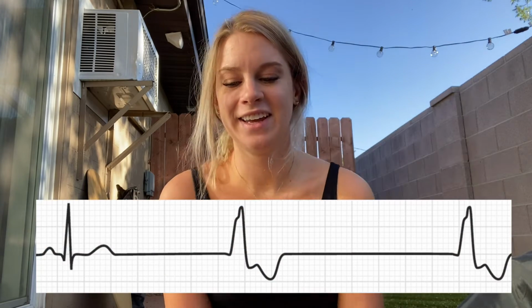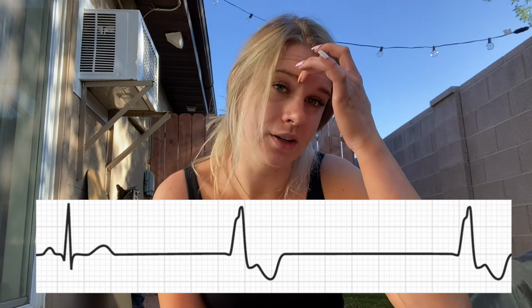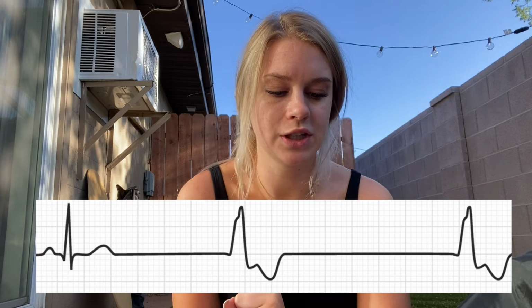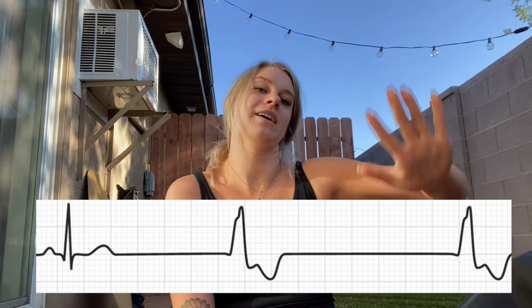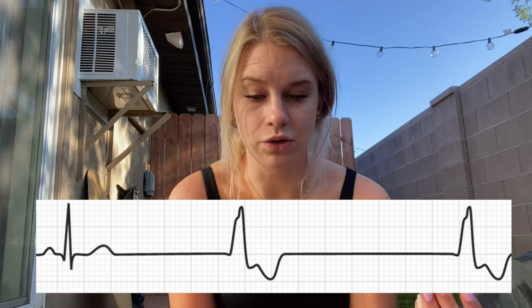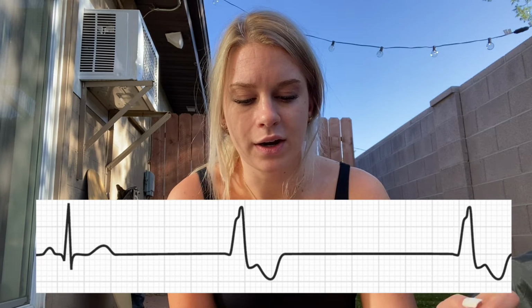Okay, let's go with idioventricular rhythm, IVR, and it's also called ventricular escape rhythm. It's related to a massive MI. So this is what happens when you have a huge MI. The sinus node fails, and the AV node fails, and there's no electricity happening. So one of the ventricular cells is like, I'll start a beat, I'll be the sinus node. So it's coming from the ventricles, and it's slow. There are going to be no P waves because the atria are not involved. The ectopic cell is on a conductive branch inside your ventricle, and it's just taken over.